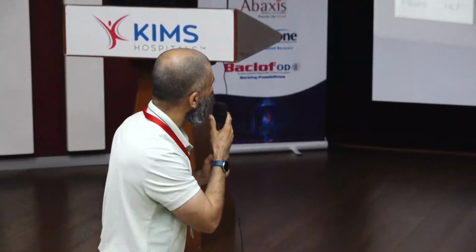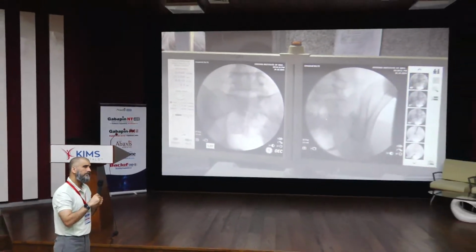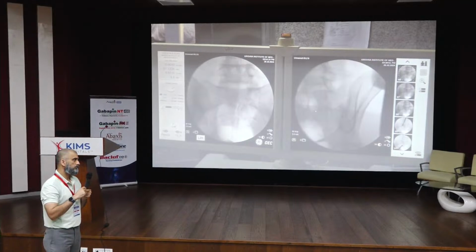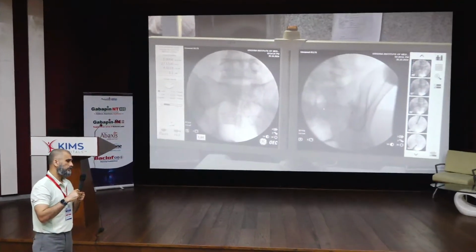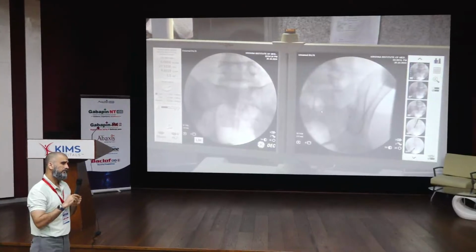Yeah, the monitoring is connected. The patient has been secured with an IV line and is in prone position. This patient has a left S1 radiculopathy. She underwent an epidural steroid almost 1 year back with transient relief. She underwent an interlaminar epidural 1 year back, which had relief for hardly 2 to 3 months. So this time we are being site specific, giving a left-sided S1 nerve root block.